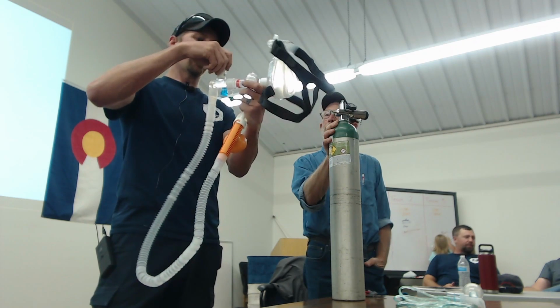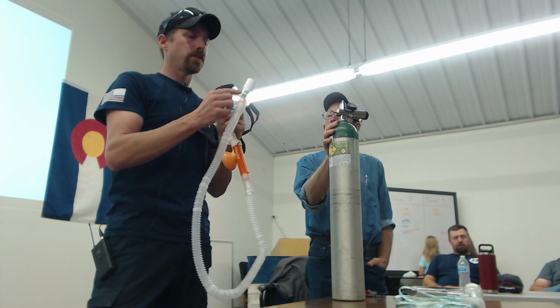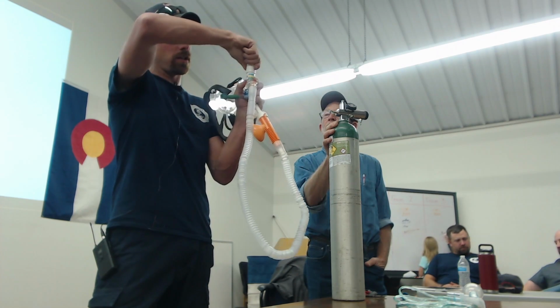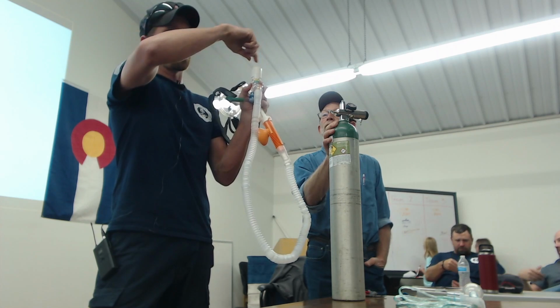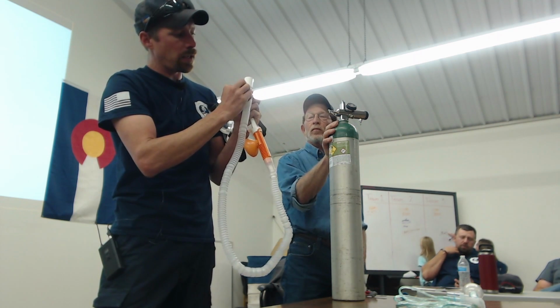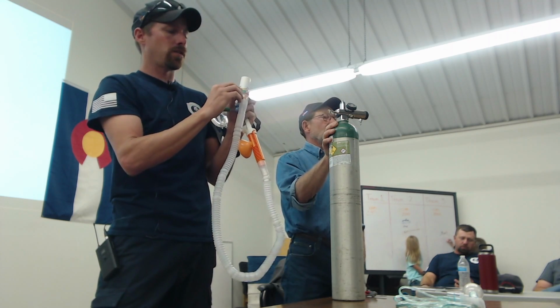The out-of-the-box PEEP pressure is going to be set at 5. You can set it to 5, 7.5, or 10, and you do that by just turning this. And there's an audible and a tactile click that you can feel. And you'll also see that the 5 will get covered up, and then you can only see the 7.5. That indicates that you're right there.